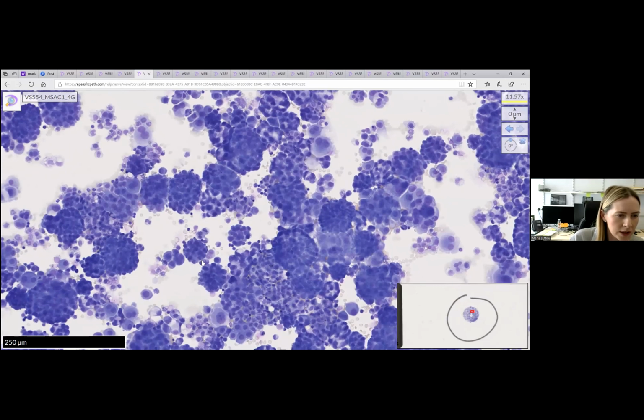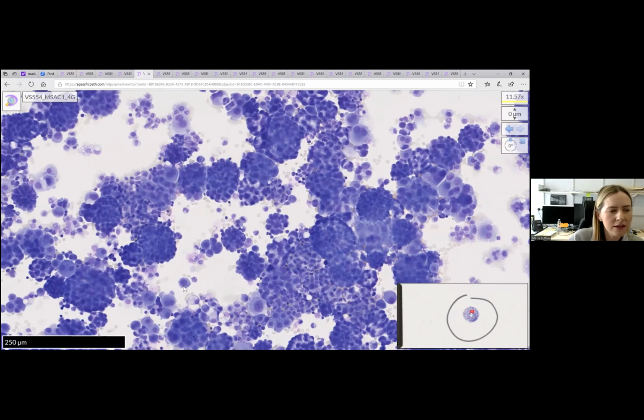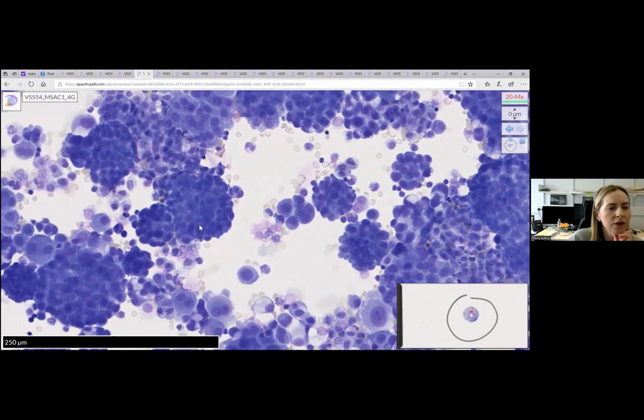And then when we look at the cells, you'll note that there are mesothelial cells in the background, and if you assess the quality of the cytoplasm, you can find that the cytoplasm of these singly dispersed mesothelial cells and those seen in the cluster are actually like for like. Similarly, the nuclei are similar to what we're seeing in the single cell distribution. And then what I'll do is look for features of adenocarcinomas. So you will look for the absence of intercellular windows, but here I can vaguely make out that we have some. And again, those are subtle signs of mesothelial origin.